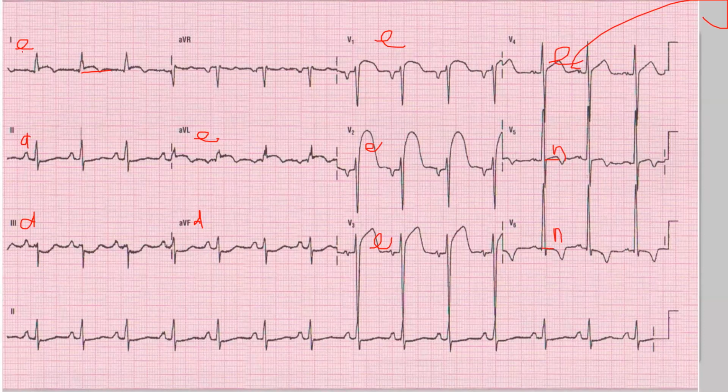Okay. So we have ST elevations in 1 and AVL. This is a high lateral wall MI. So yes, we have an MI. Because you remember, you need 2 or more contiguous leads. And 1 and AVL look at the lateral wall. None of you were able to identify that, but it is a lateral wall, high lateral wall MI.